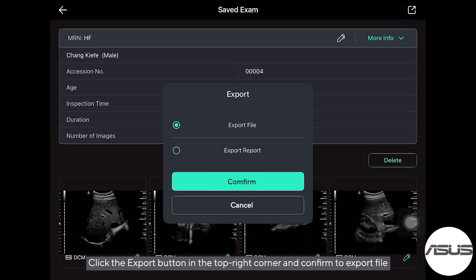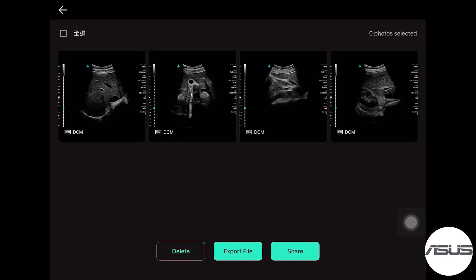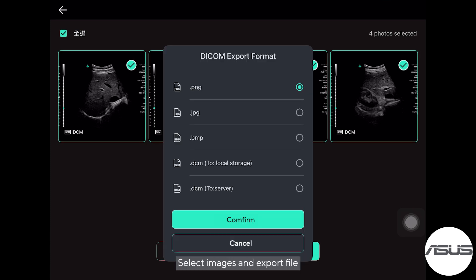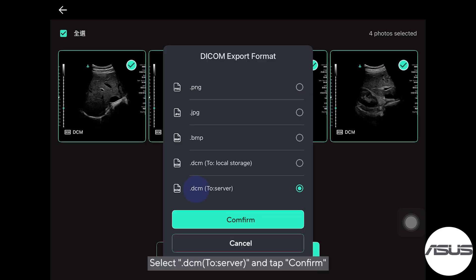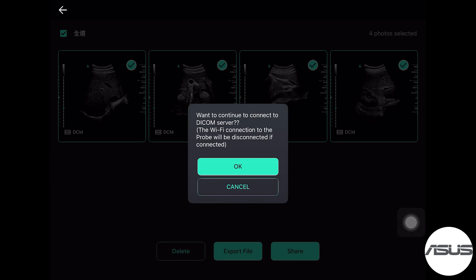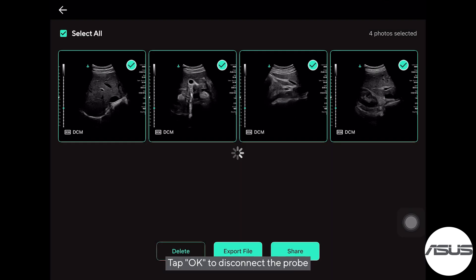Click the Export button in the top right corner and confirm to export the file. Select images and export the file. Select DCM to Server and tap Confirm. Tap OK to disconnect the probe.